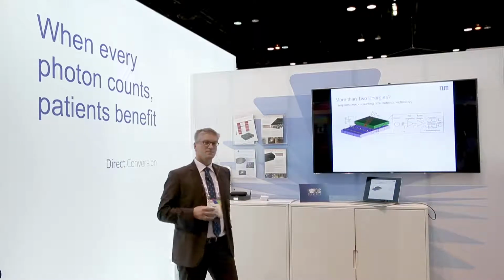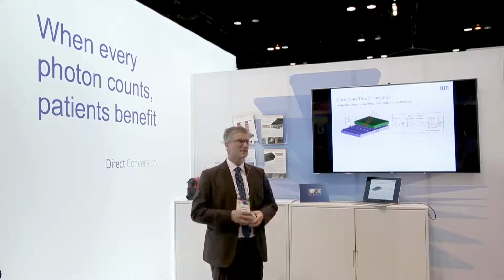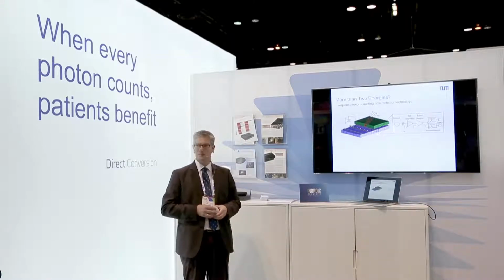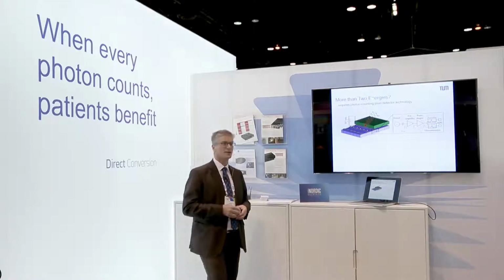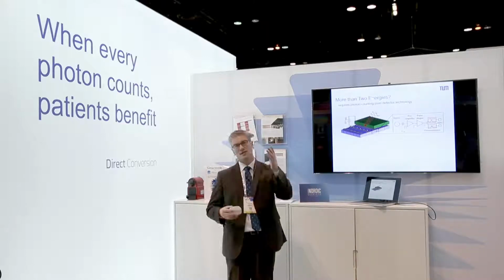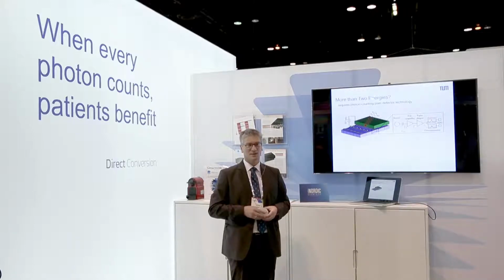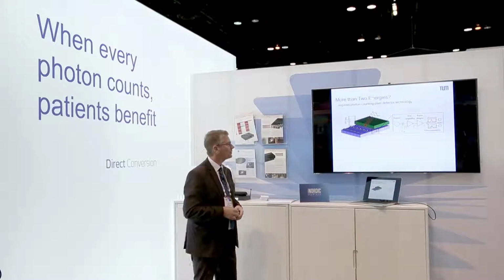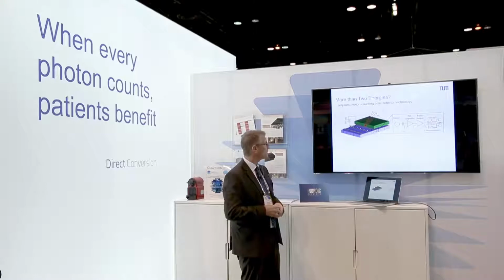Okay, now more than 2 energies. This is what's coming up. You have seen that dual energy, or using 2 energies, is already quite effective in clinical use. Now, if you want to move beyond that, you have to change the approach, because with kVp switching, using 2 layers or 2 sources, you can't really cram another source and detector into the gantry. So you switch detector technology to photon counting. Photon counting was explained in detail yesterday by Krista. I'll just summarize that here quickly.